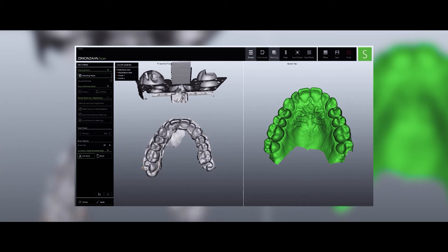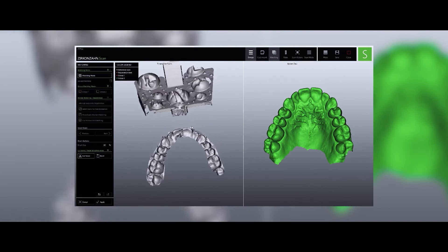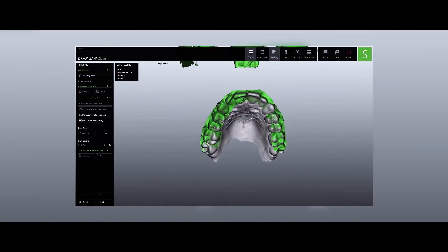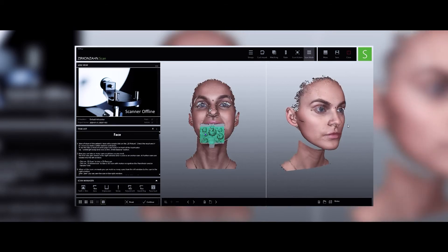We import all the patient's digital data in the scanning software and match them. After positioning the models and transfer fork, we concentrate on the creation of a unified face. Following an orderly protocol, we perform a basic face scan — a complete face consisting of three scans.